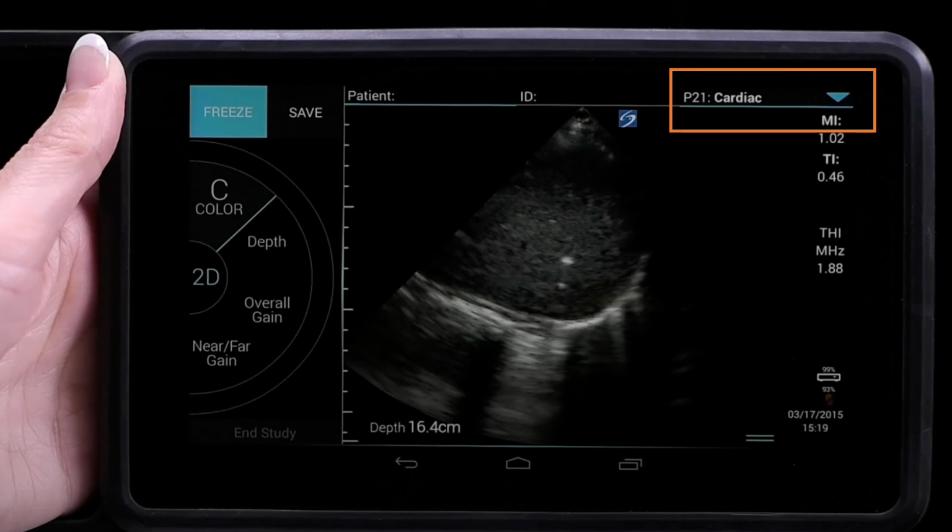One important thing to understand in the top right of the screen, it says cardiac. That's the type of study that we're doing. Now, it doesn't have to be set to the exact study that you're doing. Often there's an abdomen setting or an OB setting or cardiac setting, but what that does is it optimizes some of the things like contrast and gain and other settings in the machine. It automatically optimizes it to that study type. So you can do a FAST exam on the cardiac setting. You can do it on the abdomen setting, but you might find that the abdomen setting actually gets you a better picture on the machine itself, but don't worry too much about it.